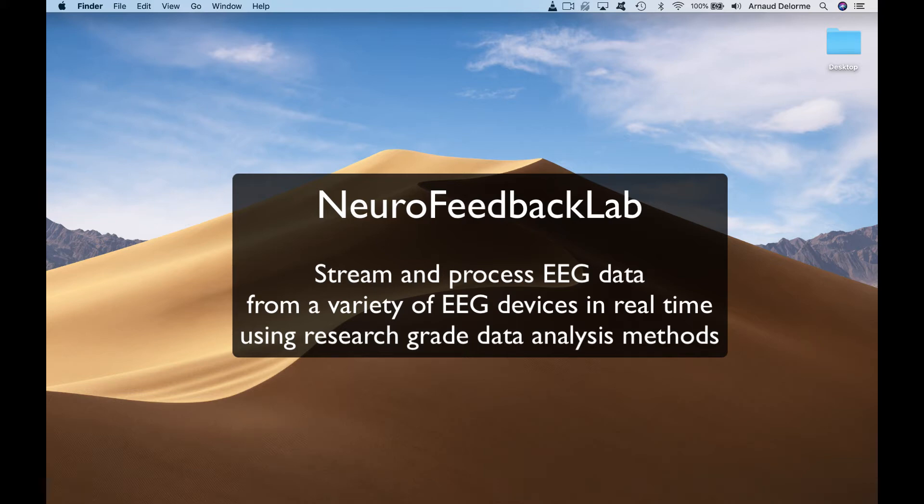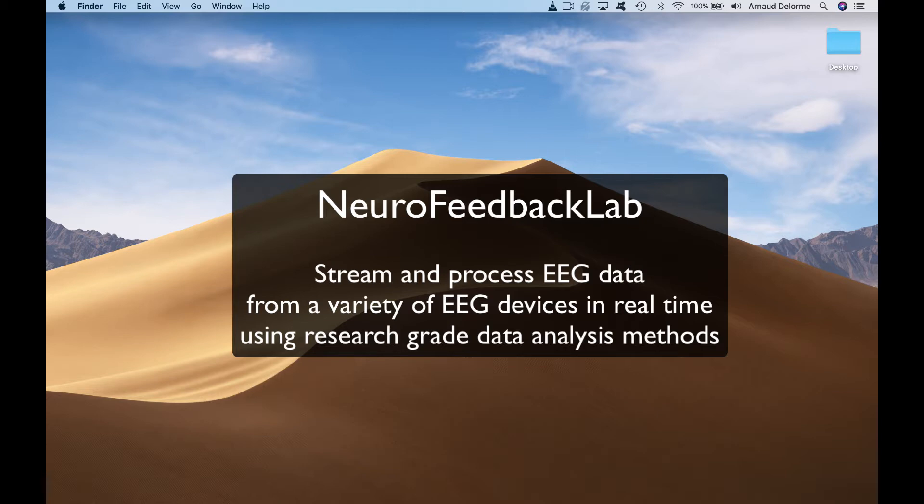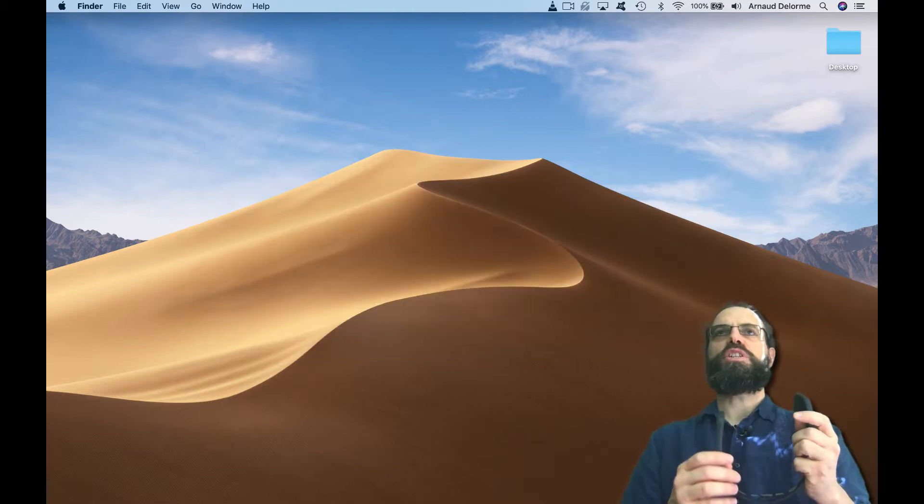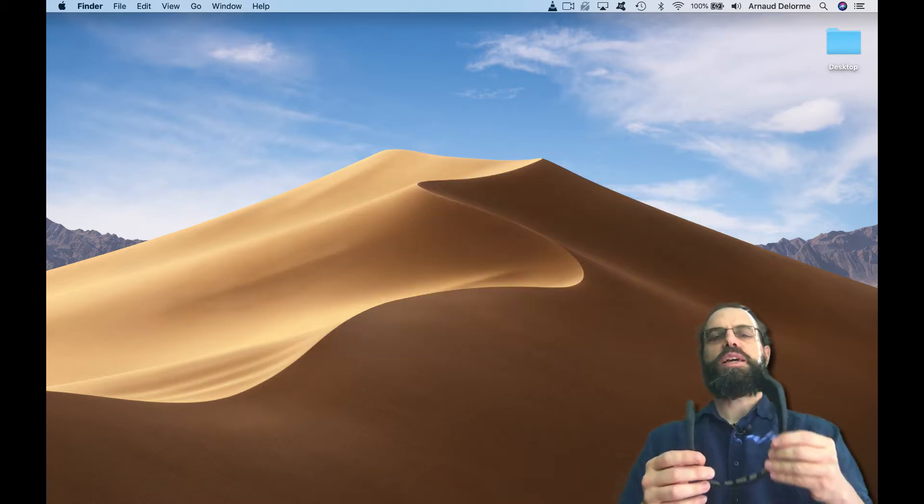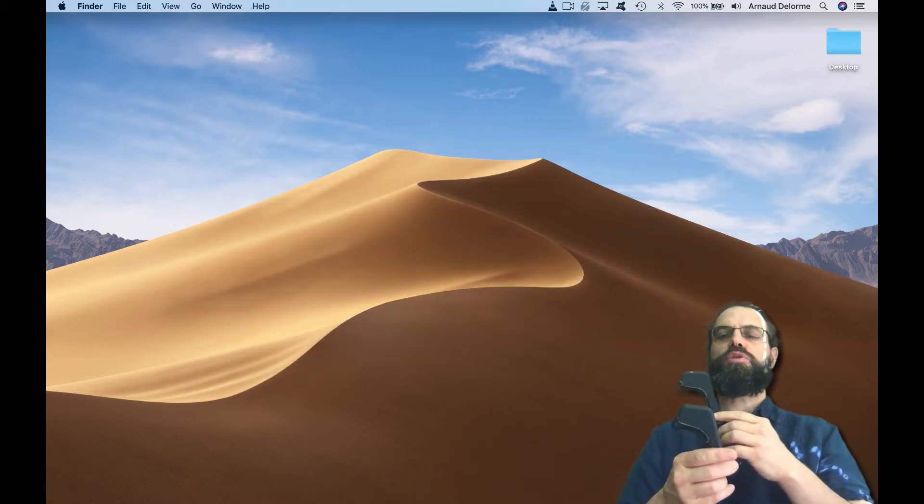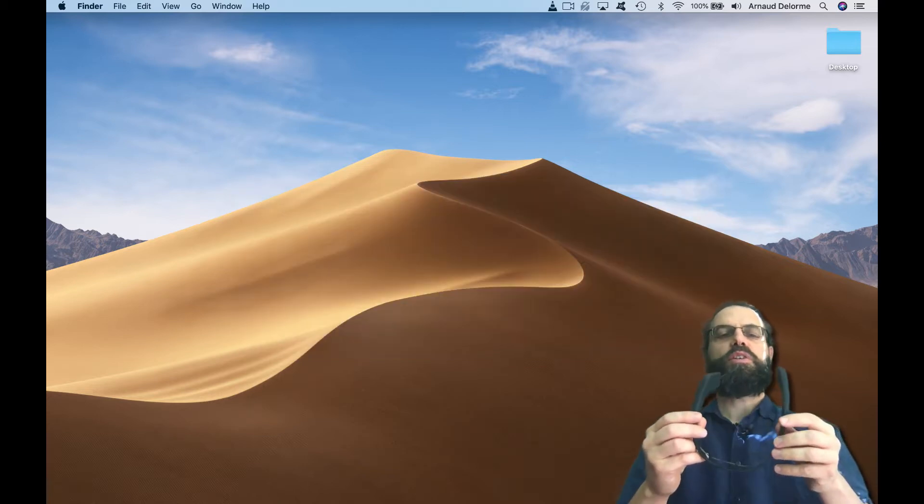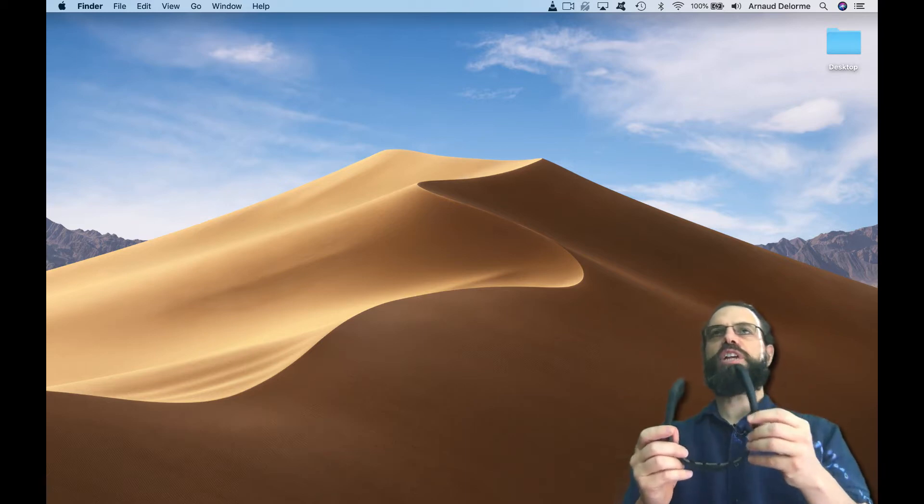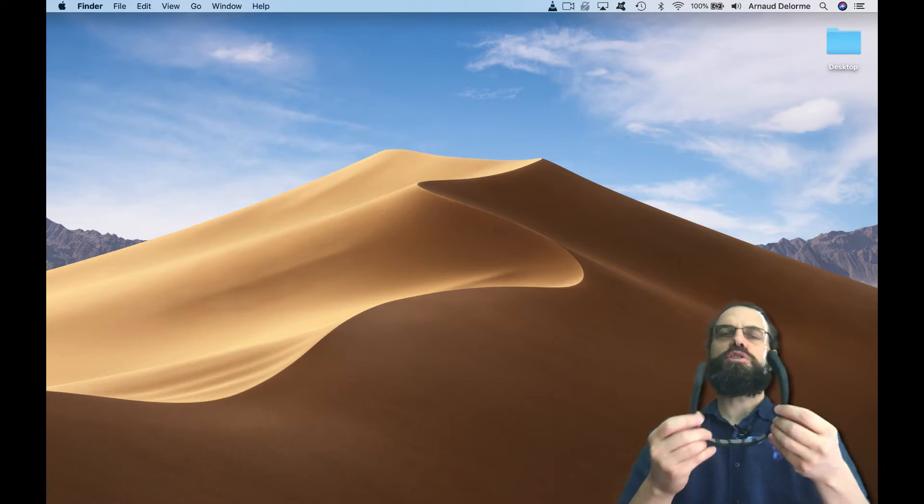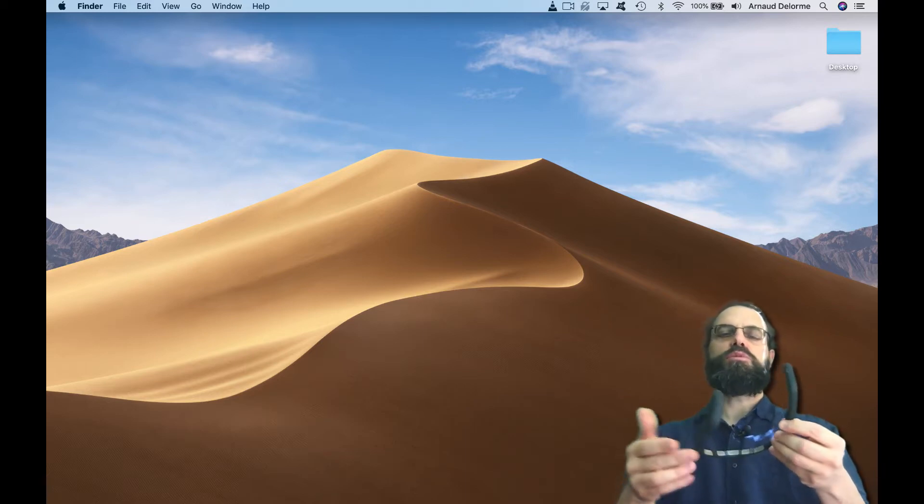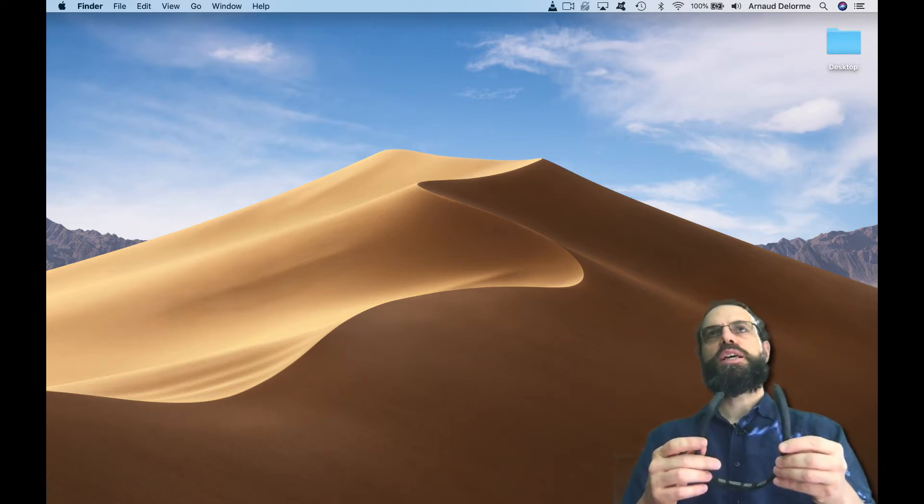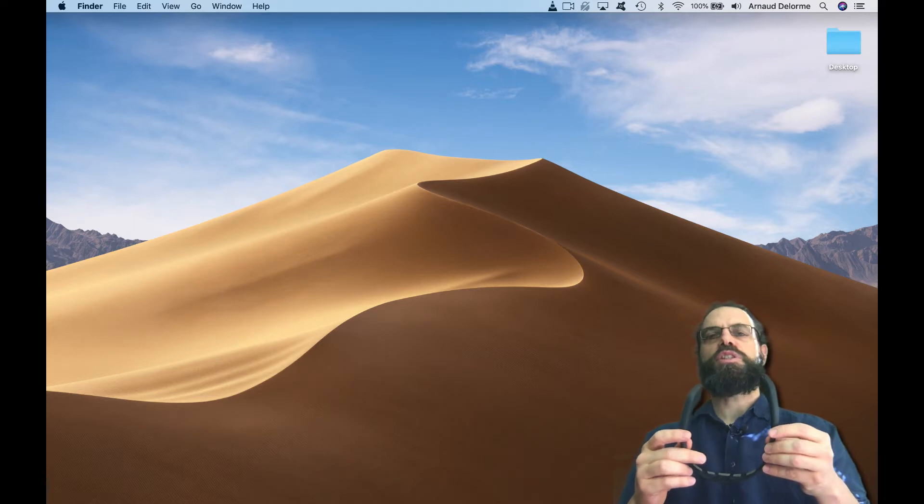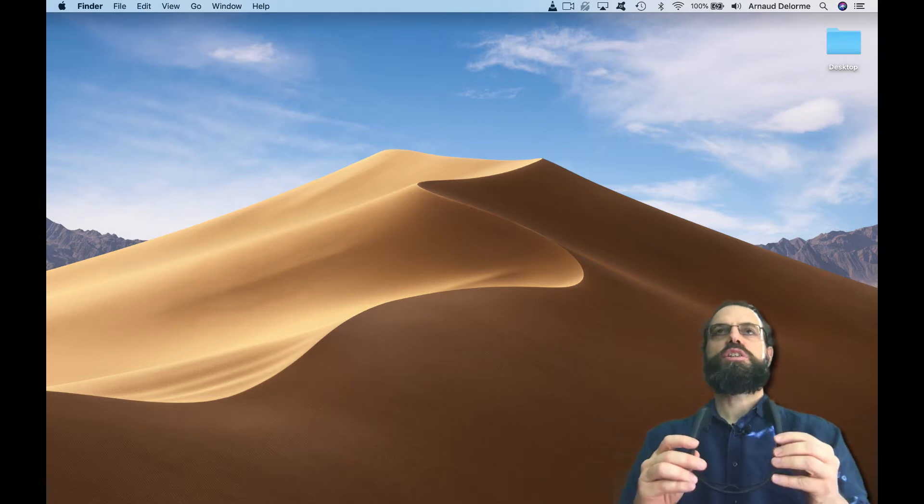Hello, my name is Arnold Delorme and I'm going to show you how to use a program I made called Neurofeedback Lab to record from EEG devices and do processing and feedback in real time. It's a free program, so we'll see how to install and use it. I'm going to do a demo with a Muse headset, though it works with many different headsets.